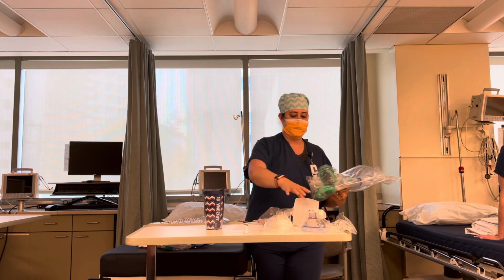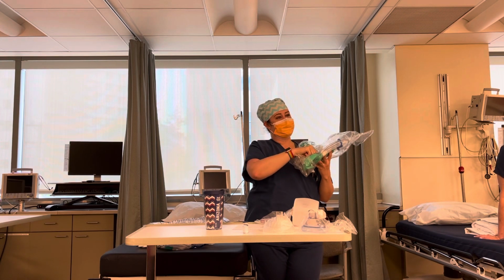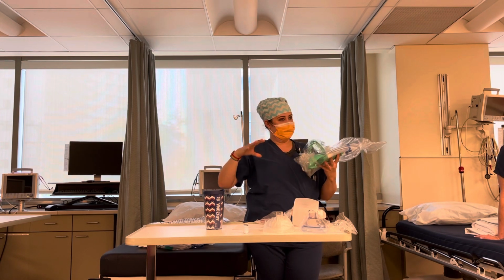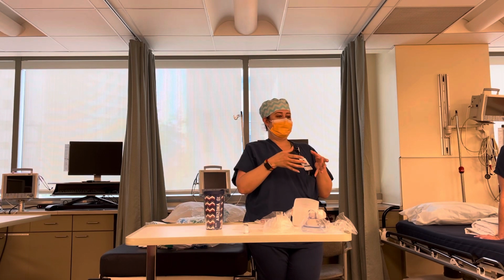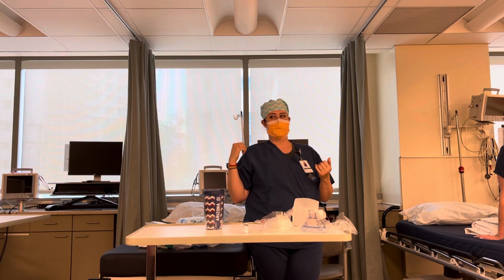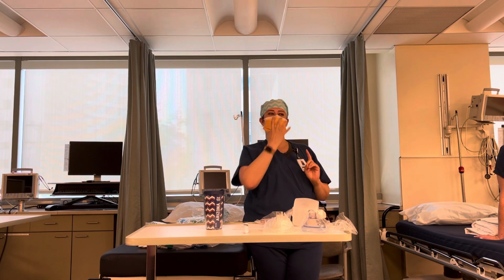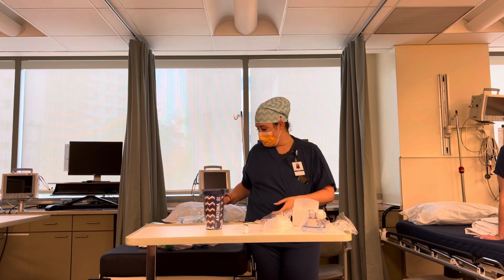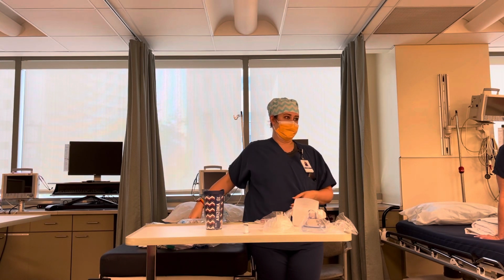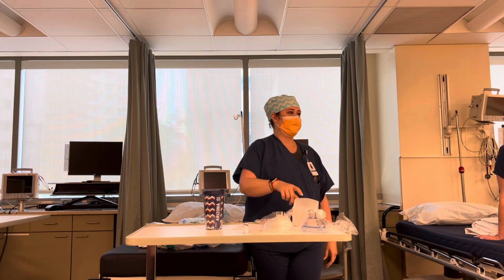The bag on an ambu is just stiff. This, it's like the patient's lung. It's almost like a lung outside of their body, so that it's flexible, so that if they're trying to breathe on their own, you can actually, I've showed you guys before, we're running low on them, so I don't want to waste one right now. Otherwise, I'd put it to my mouth and show you guys how it moves with a breath. But we can actually feel the patient's effort that they're putting into it when we touch this bag, and you can see it. Whereas with an ambu, you can't.